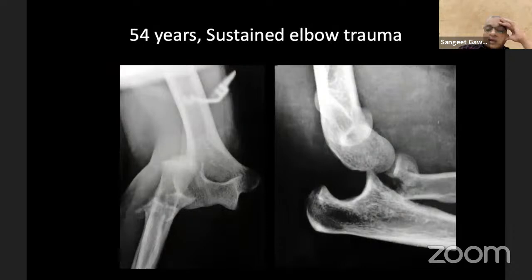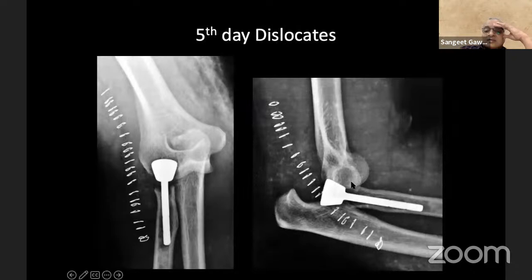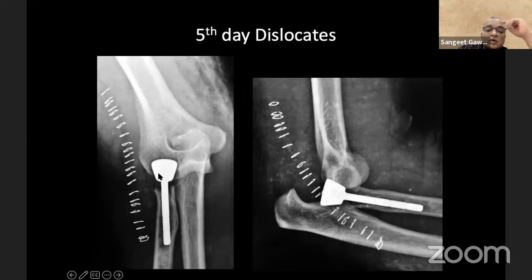Another situation, a 54-year-old, he sustained elbow trauma. Again, the coronoid is intact. He has a radial head which is comminuted. Okay. It is in multiple fragments and the elbow is dislocated. Now here, the surgeon has done the replacement surgery, but he didn't address the lateral collateral ligaments. So hence, what has happened is obvious on fifth day. Okay. So you need to repair. That is the reason you need to repair the lateral ulnar collateral ligament very well, so that these dislocations which are associated with radial head are stable and they get back an expected range.